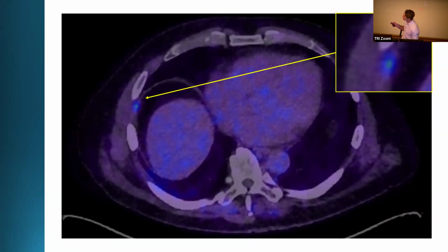In fact, this was another one of our patients who had pancreatic cancer. The reason for doing this scan was to look for distant metastases. This is about a 5 millimeter peritoneal deposit, which was not visible anywhere else. PanIN by definition is about 5 millimeters, but we think in more recent literature that the high-grade PanINs can get up to about 1 centimeter.